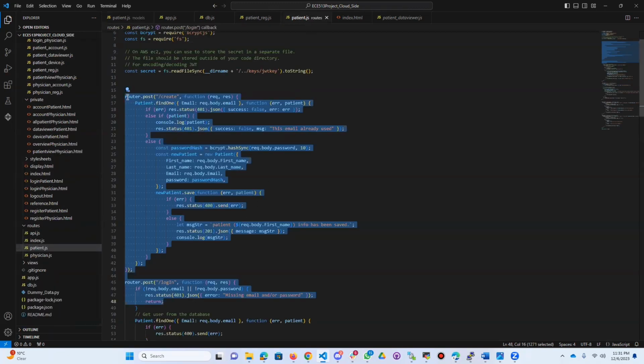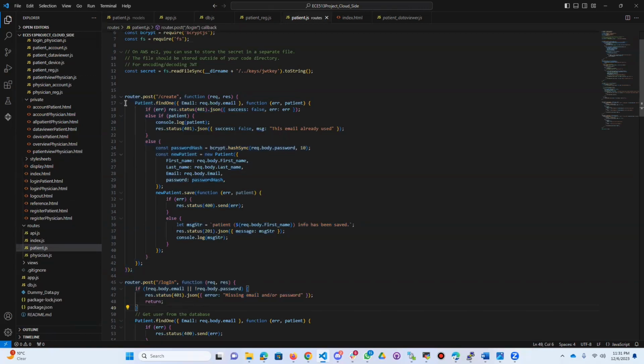Yeah, and here we can see one of the parts of the code which is very important, which is the create route here. This piece of code defines the structure or schema for storing patient information in the MongoDB database, and it includes details like the patient's name, email, password, the last time they accessed the system, their assigned physician, and information about the monitoring device.